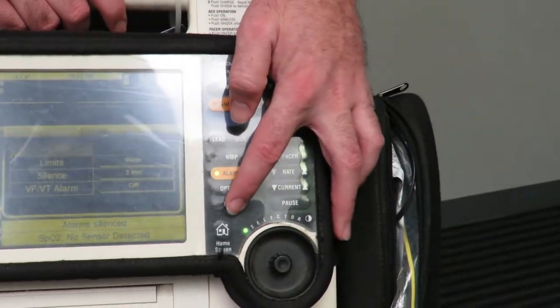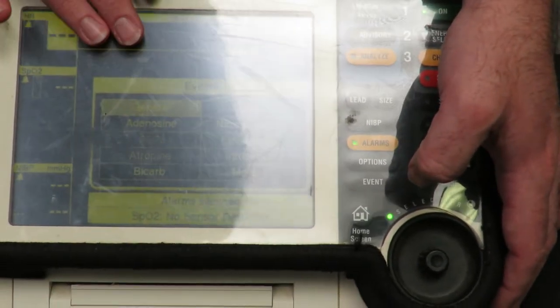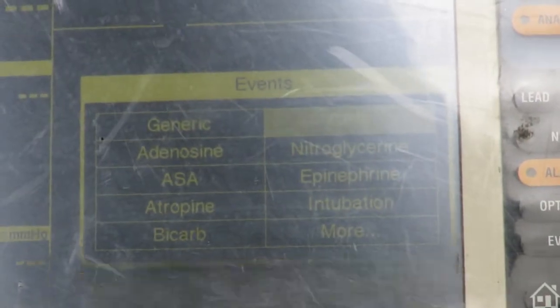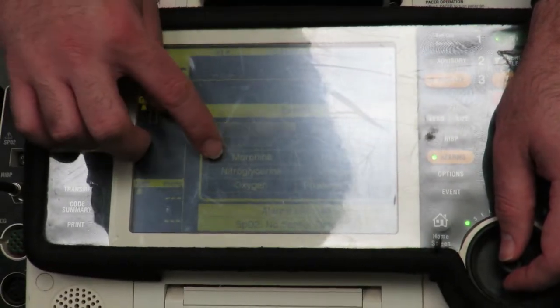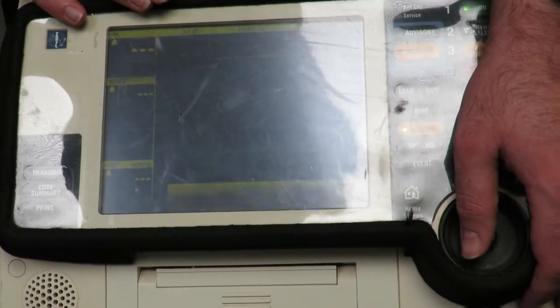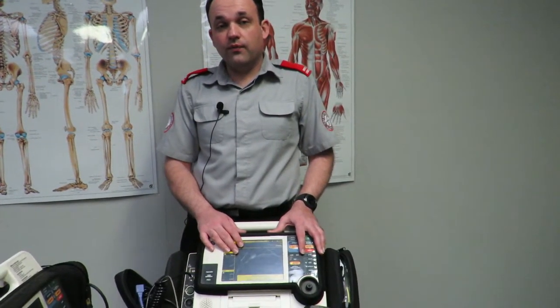The unit also has an event feature. If you're doing CPR, press 'event' and it brings up a list of pre-programmed events that will time-stamp in your code summary. For instance, select 'commenced CPR' and it tells you CPR was commenced at 10:04 and time-stamps that. You can do this for a multitude of things — the second page has IV access, morphine, oxygen, nitroglycerin. So if you give GTN, select it and it's time-stamped. This is important for PCRs and keeping accurate event history.